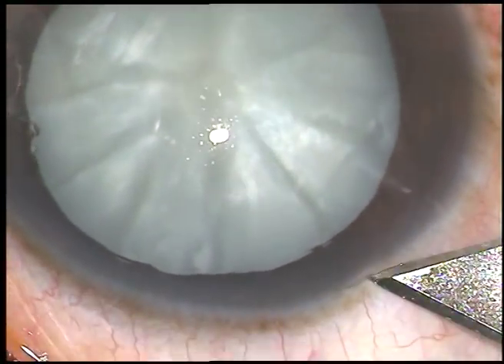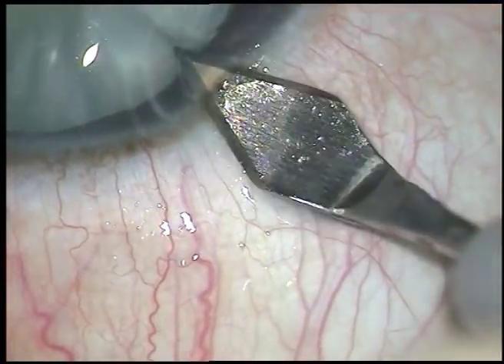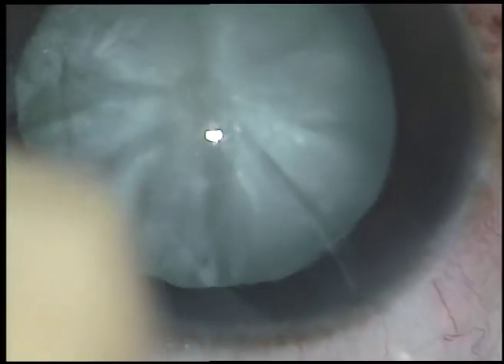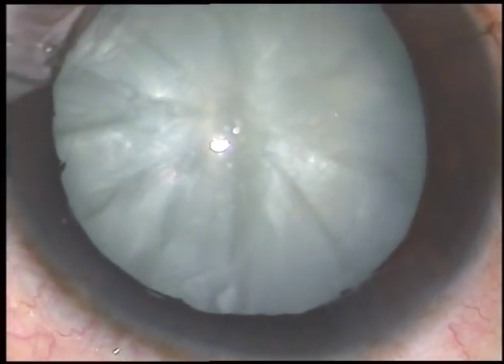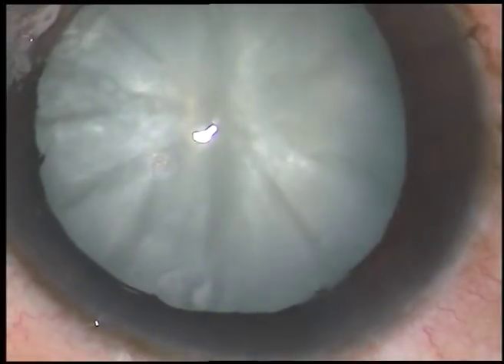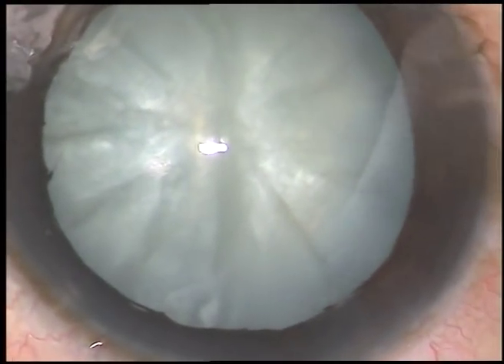Dear colleagues, this is focal liquefaction of an intumescent cataract. It is often said that you need a femto or a Zepto for capsulorhexis in cases of intumescent cataracts. But it is not so. Please watch this surgery.